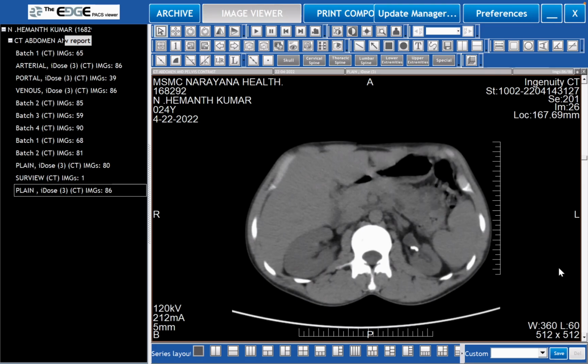If you are looking at it from the radiologist's point of view, then chronic pyelonephritis has to have a scar. And that scar will be opposite an area of the collecting system. Why is that? That is because of the anatomy related to the collecting tubules, the ducts and the papilla, etc. So scarring in radiological terms is an area of depression or alteration in the renal silhouette with an associated abnormality in the overlying or underlying calyx.